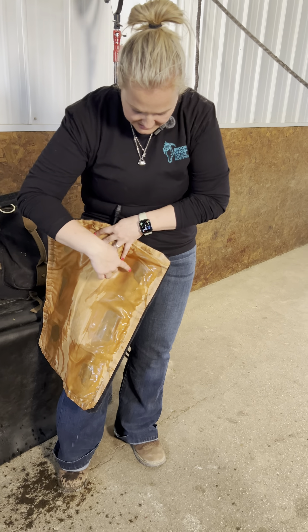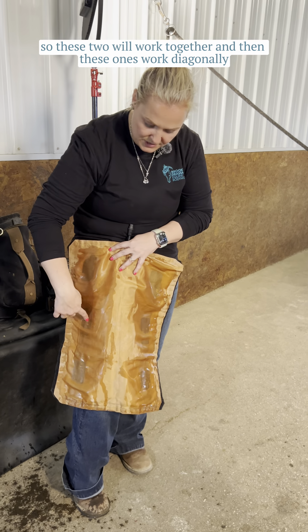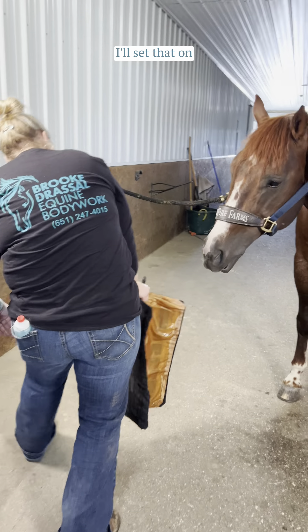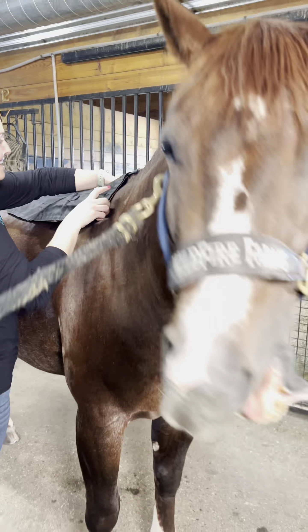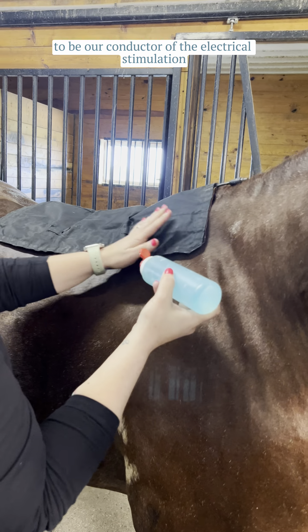On here you've got three electrodes on each side — one, two, three, and then one, two, three. These two will work together, and then these ones work diagonally. I'll set that on, and then I use ultrasound gel to be our conductor of the electrical stimulation.